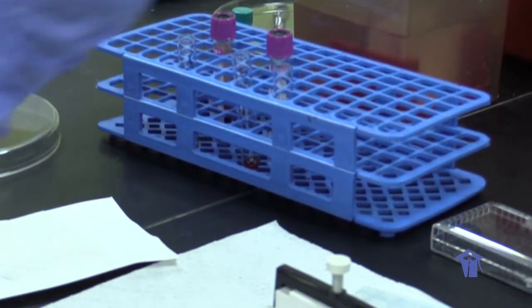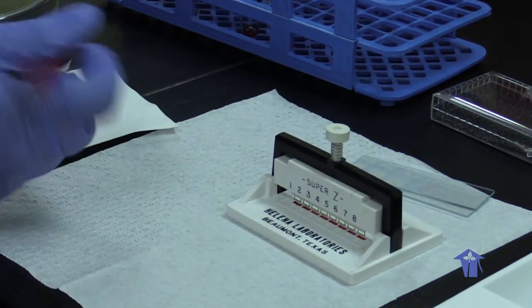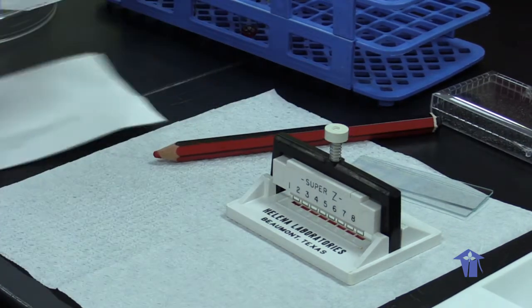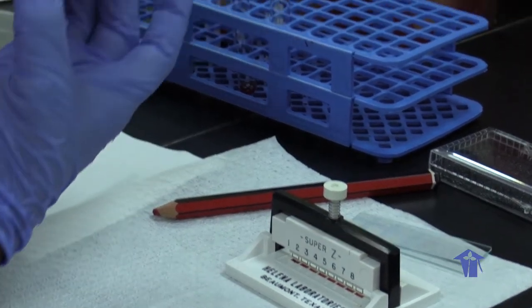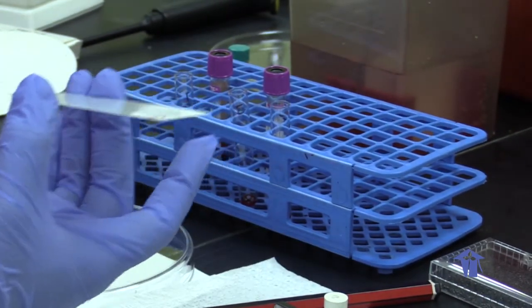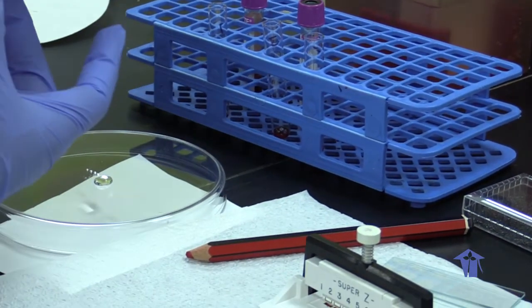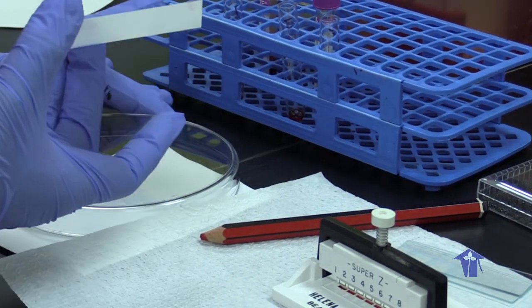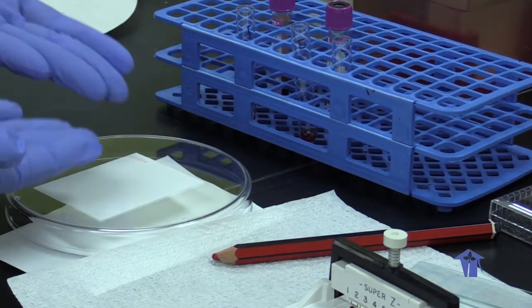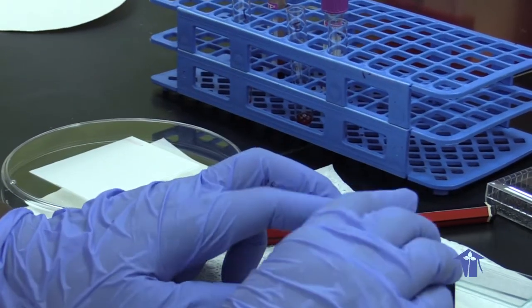So we're going to label this plate, plate 1, using a China pencil. Then, glossy side, we're going to put a drop of distilled water. This is for the plate not to stick to the surface, and we're going to flip it over to get our cellulose side up. Now we're going to apply the sample.